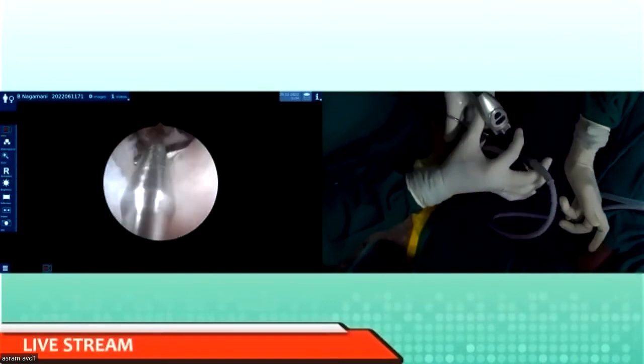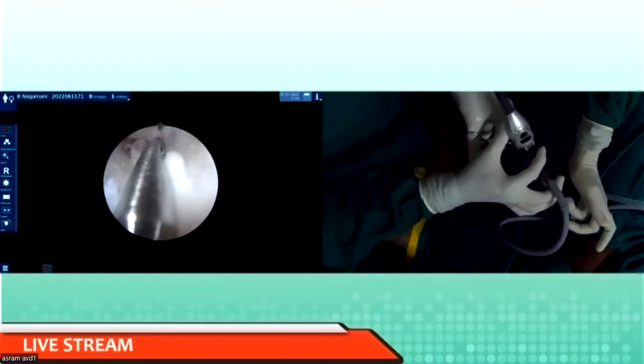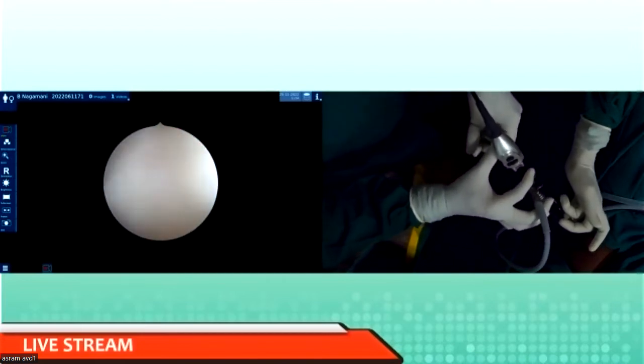That is the cervical canal. You are coming, yeah, this is the cervical canal. So always stand at a distance and you cut it. Okay, sir. Can you see that? Now you almost cut it, and if there were to be some bleeding.